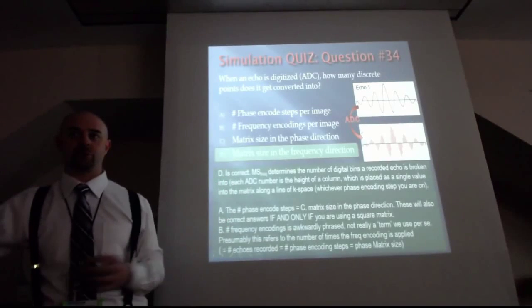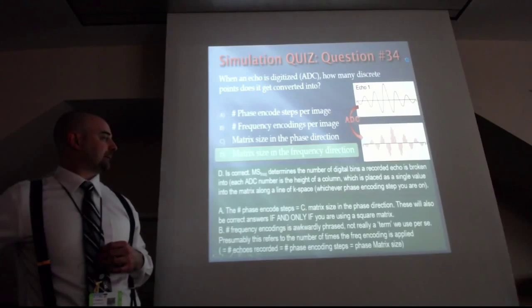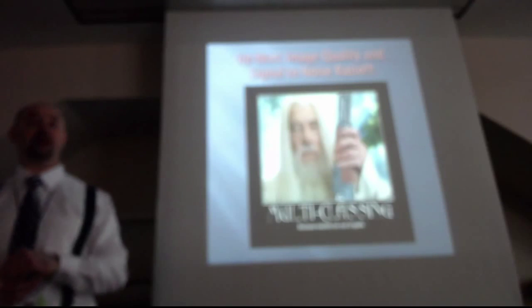This is a pretty tough concept. Okay. All right, and that's it. So next we'll be talking about signal to noise ratio and imaging quality.